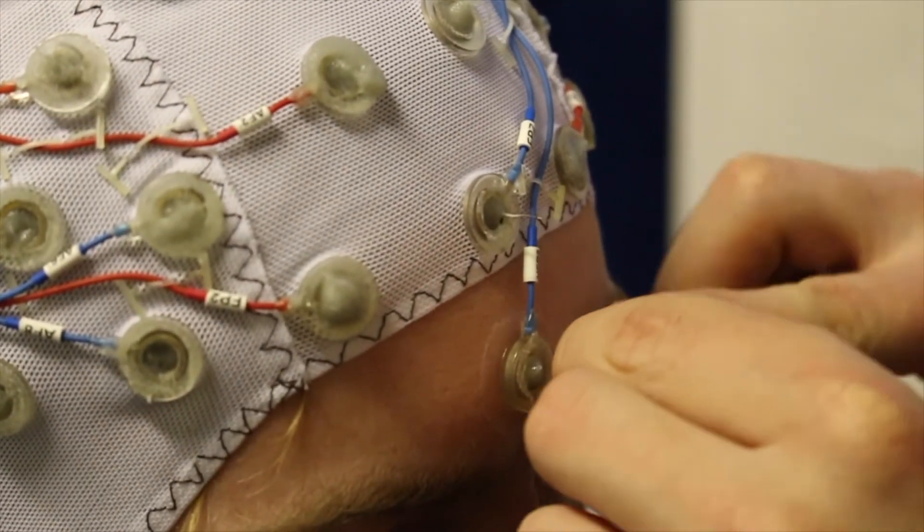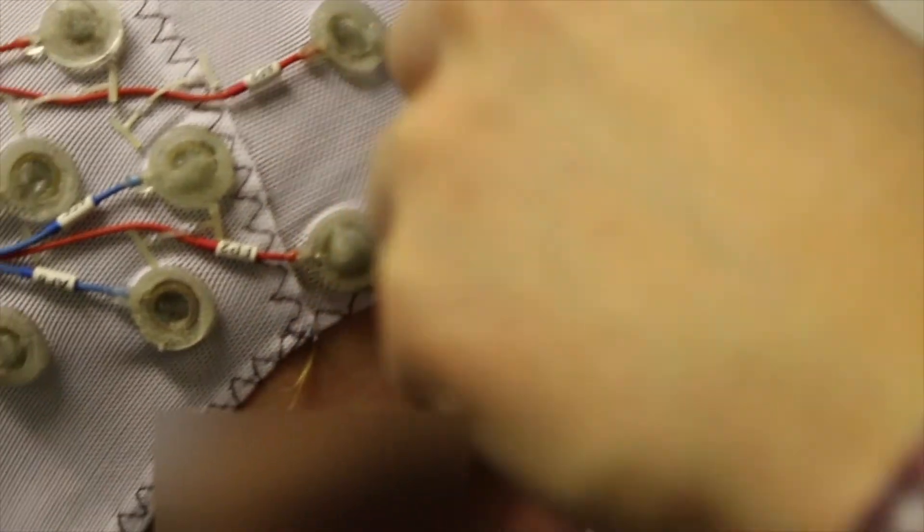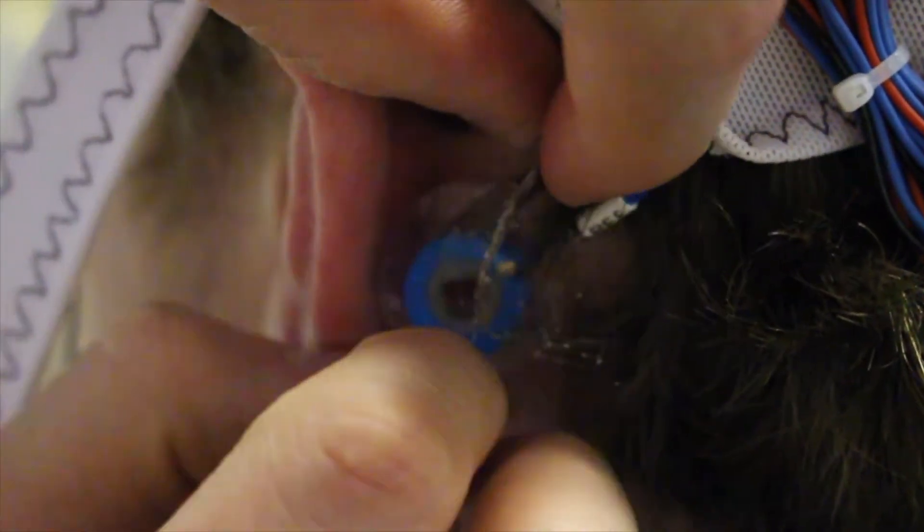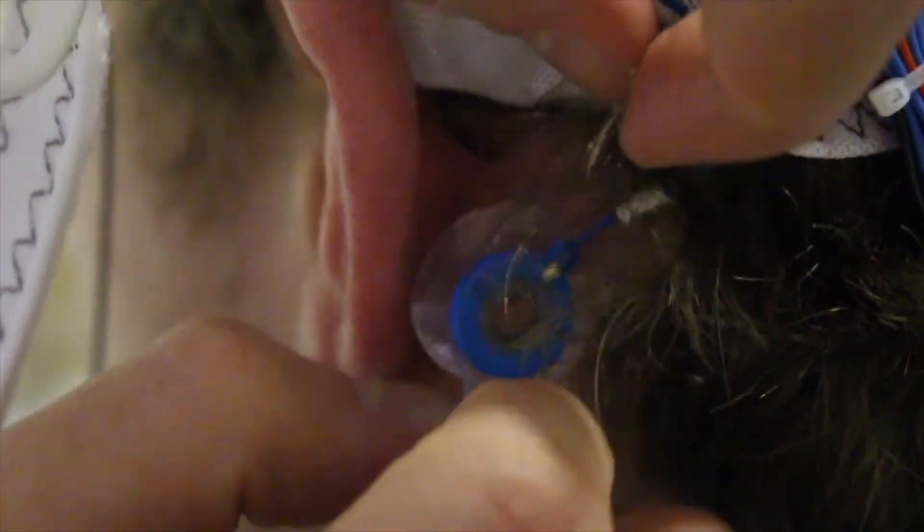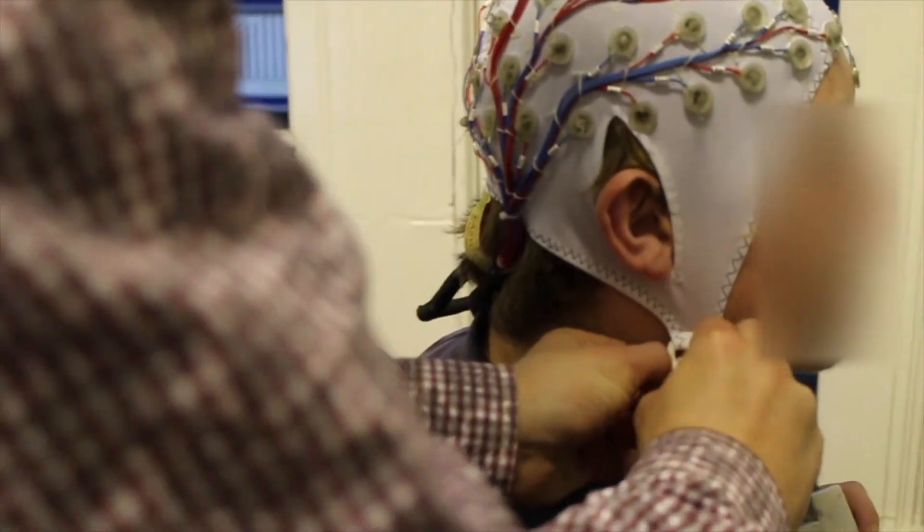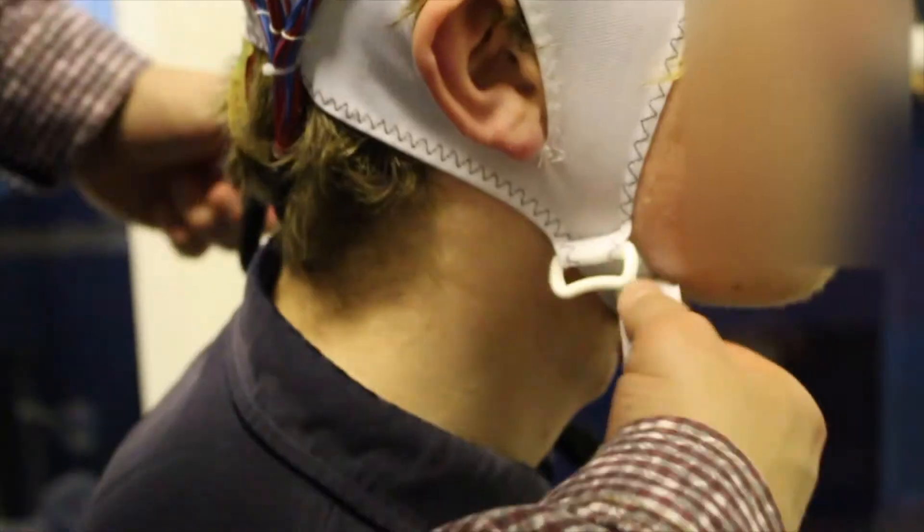Seat the participant, then gently remove the three loose electrodes by lifting up by the tab. Be careful not to pull any hair if this has gotten stuck to it. If you have used the chest strap, remove this before undoing the chin strap.